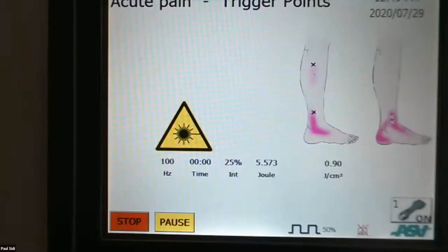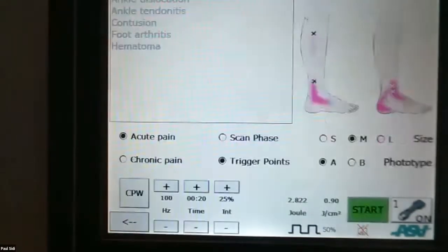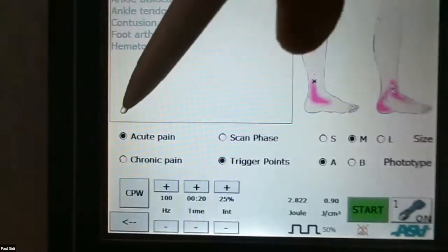What we do is we just change the setting here. This isn't for a trigger point. We're going to use the trigger point setting, but it's for a very sore area. Works very nicely. Right, we're on here now. Where's the pointer? Okay, let's get off here. Bang. Right, we're going to trigger points, acute trigger points.